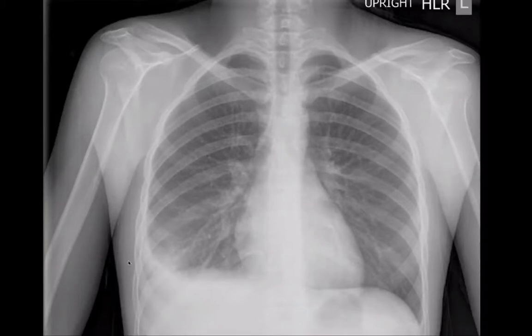Could it be a pneumonia? It could be a pneumonia. The problem with this patient is that pneumonias are usually not in the periphery, and this looked a little bit wedge-shaped or triangular in nature. And sometimes that occurs when you have a pulmonary embolism or a blood clot in your lungs, or you can have a pulmonary infarct, basically. And the way the blood flow of the lungs occurs, it gives that wedge-shaped triangular appearance. So my question was, does this girl have a pneumonia or does she have a pulmonary embolism? And different modalities of imaging occur in medicine, right?